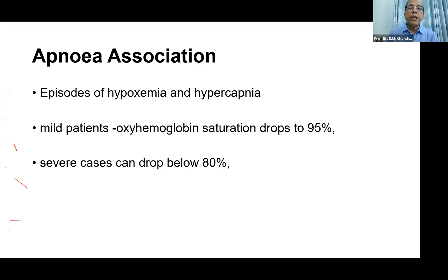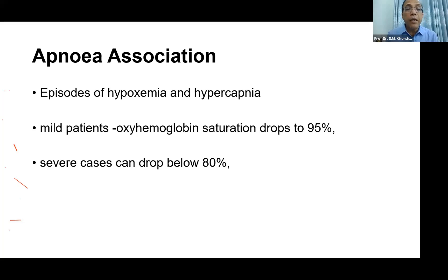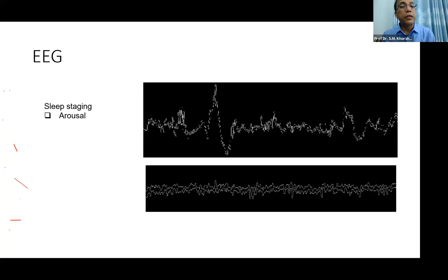There are episodes of hypoxemia and hypercapnia. If there is apnea with no dropping of oxygen saturation, it is not considered apnea. Apnea is considered cessation of airflow when associated with desaturation of oxygen. Normally oxygen saturation is 97 to 100 percent. In mild cases, oxyhemoglobin saturation drops to 95 percent, and in severe cases it drops below 80 percent. This is our labeling of the level of oxygen saturation.